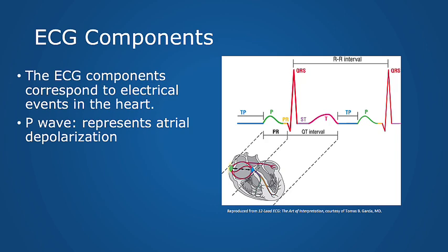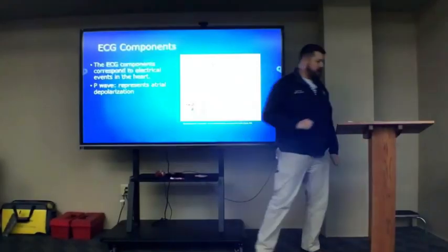Last week I told you that the T wave is the most dynamic wave. What do I mean by that? You can change it the most. It's the most affected, or the easiest affected, by electrolytes and other things. We're going to get to all that in a few minutes.